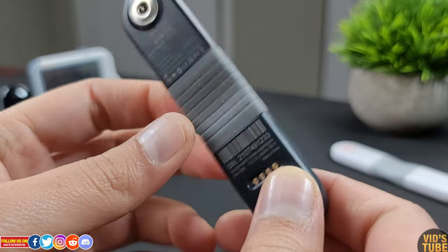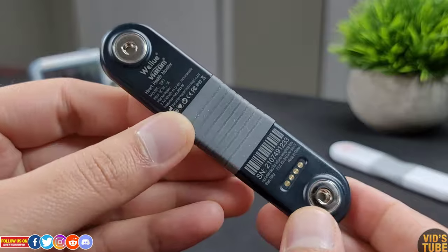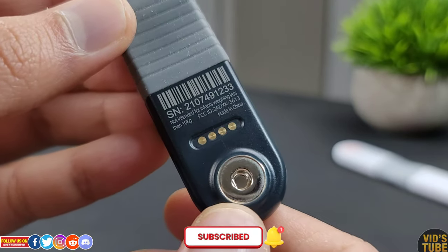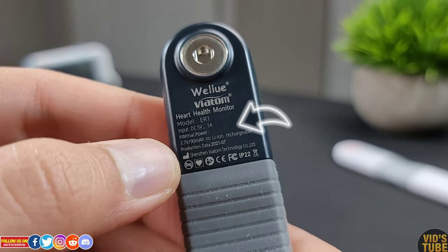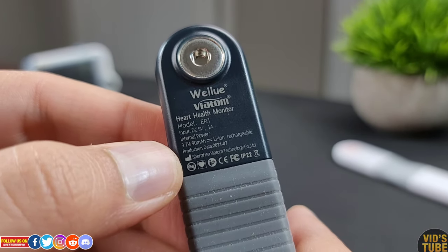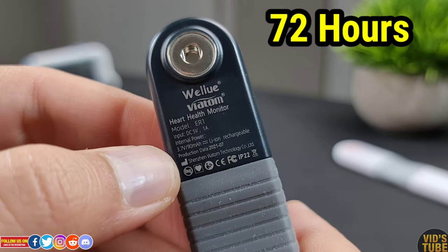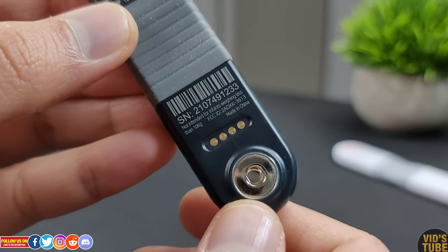At the back, there are a few printed details with the electrode attachment, and these four pins are the charging contact pins. This AI ECG recorder has a 3.7V DC 90mAh rechargeable lithium-ion battery which can record continuously for 72 hours when fully charged, and it takes about 2-3 hours to fully charge.